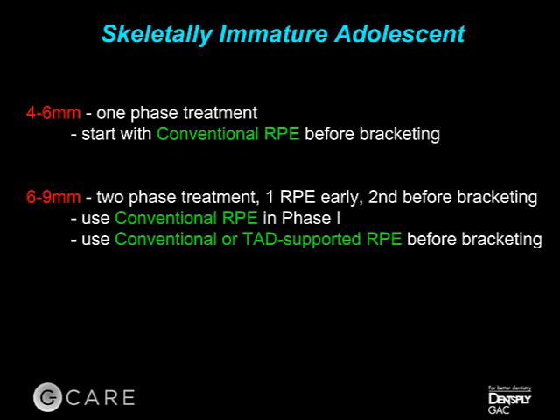This also goes to saying that if we use a lip bumper to upright the teeth, which were lingually inclined prior to the first expander, and we do happen to gain bony change, we'll just remeasure, and if we need to, then we'll re-expand. So that's why I said it's not really clinically significant to me whether or not we can get a lip bumper to have bony change in the mandible, because I'm going to remeasure and re-expand as needed if that does happen.